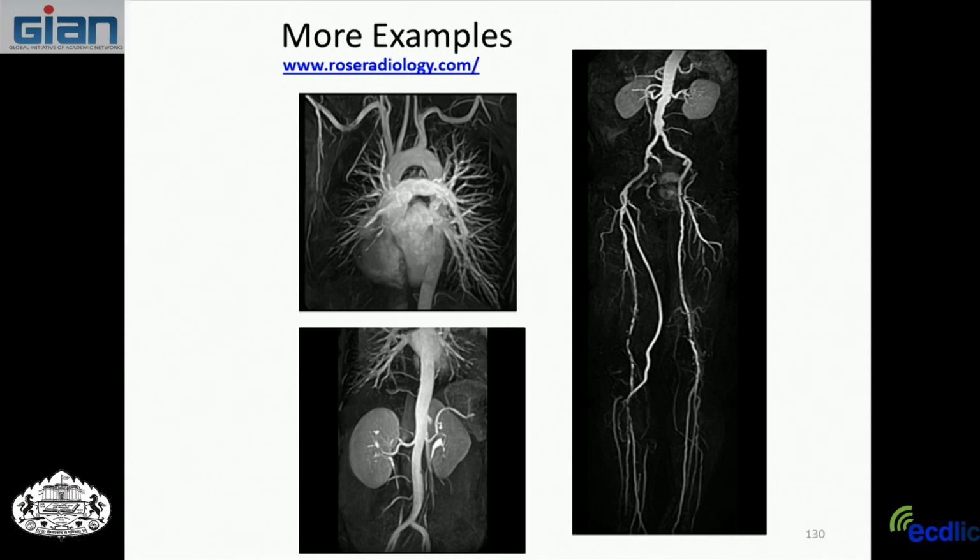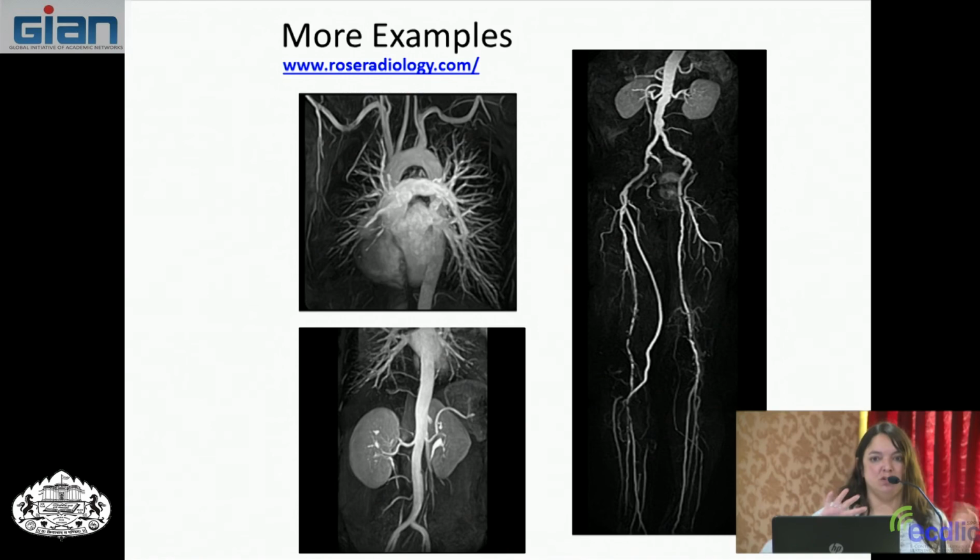And so typically before, to measure blood vessels, you had to inject some kind of a dye and then watch as they flow through the vessels. But by using these properties of the tissue and using the fact that you can flip different times and measure different times as the blood flows through the vessels, you can get these really nice images of vessels without doing these contrast injections.